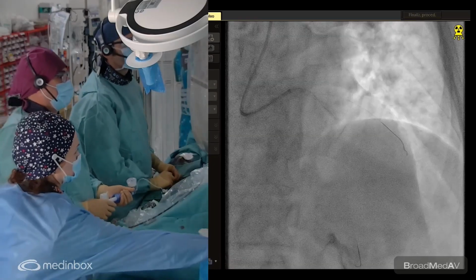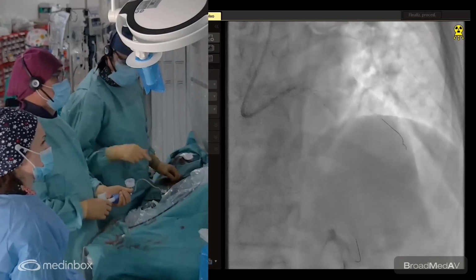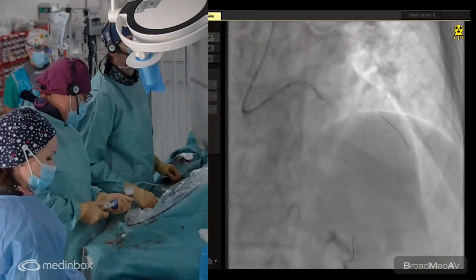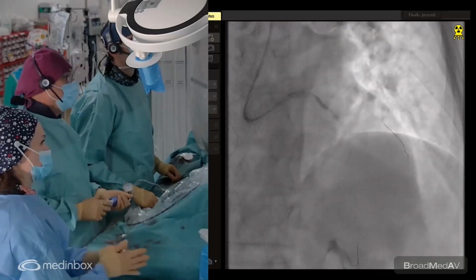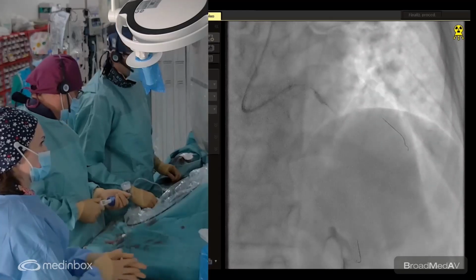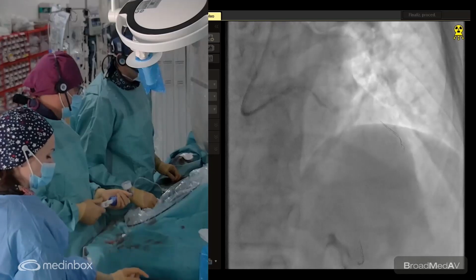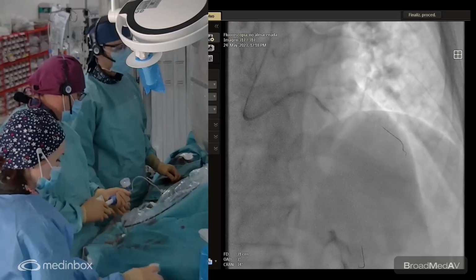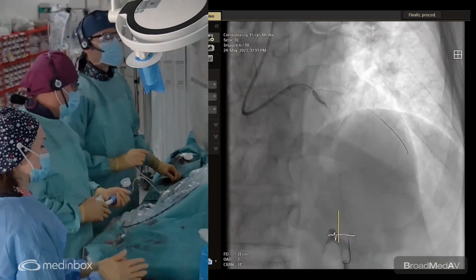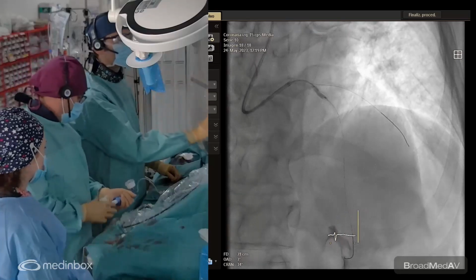Okay, down. You can see in the hemodynamics that the patient is doing some extra beats. In the ECG. Okay, let's do another run. 4. And applying the second cycle of 10 pulses. The blood pressure is okay. 6. Yes, you can see the EKG captures.